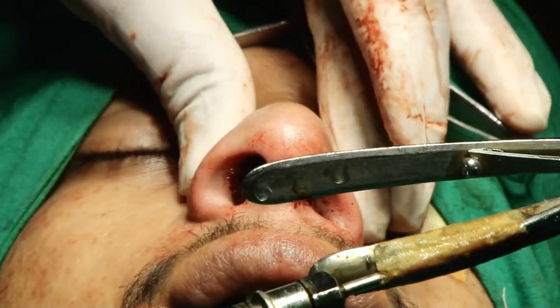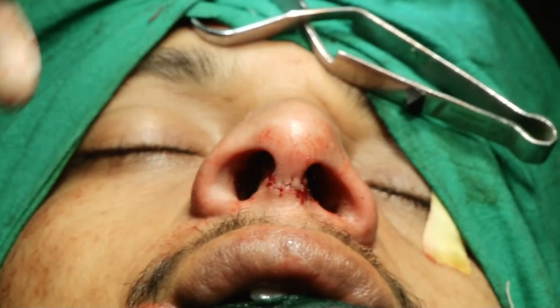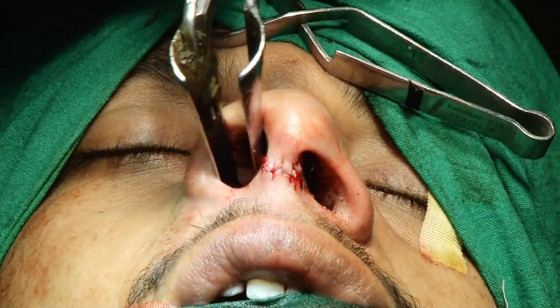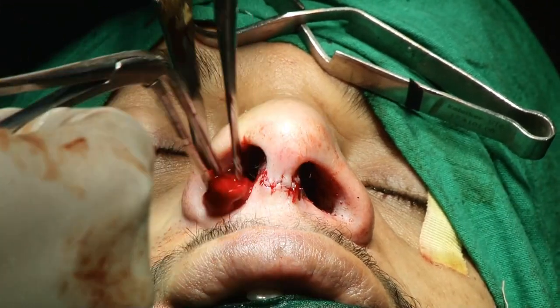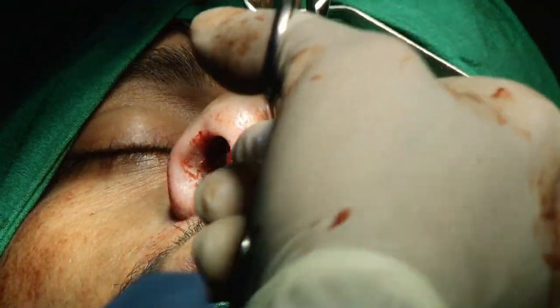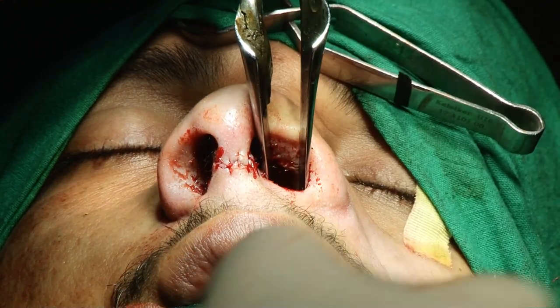So when you suture your marginal incision, you never suture the margin of the cartilage. You suture only skin to skin. It's a very important message for my regular friends. Otherwise, you create unnecessary deformity.